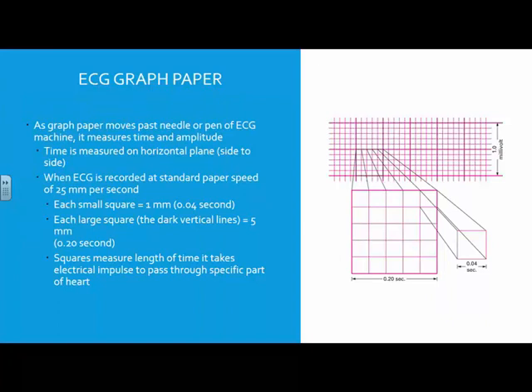Well, let's see, what else can we tell you on that? The little tick marks at the top. Those are a 3-second interval, right? That's right. So they're there for quick reference. Your little tiny tick marks at the top, in between one and the other is going to be 3 seconds. And so if you're looking at 1, then 1 in the middle, then 1 on the end, that's going to be your 6-second strip. Okay? It's going to be important.